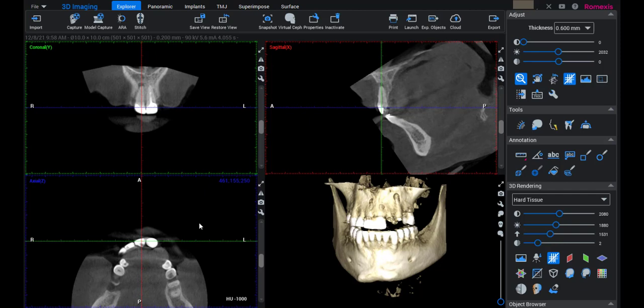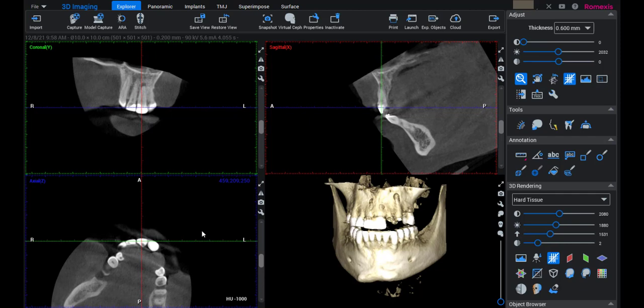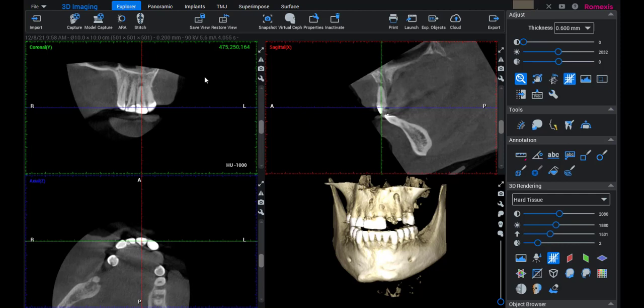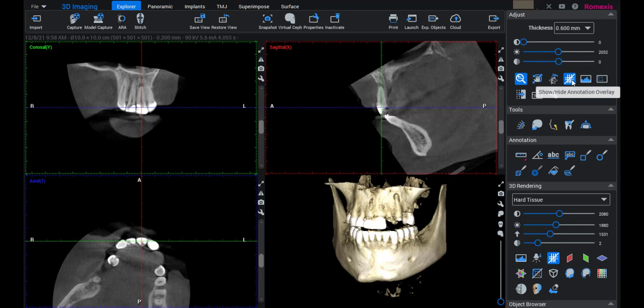In the axial view, I'm going to hold the right mouse button and rotate. I want the coronal and sagittal views to look like a target — the sagittal going straight labial to palatal, and the coronal going straight mesial to distal. Then in the coronal view, I'll rotate slightly so the lines are in the canal of the tooth. When you do that, it sets us up for success.